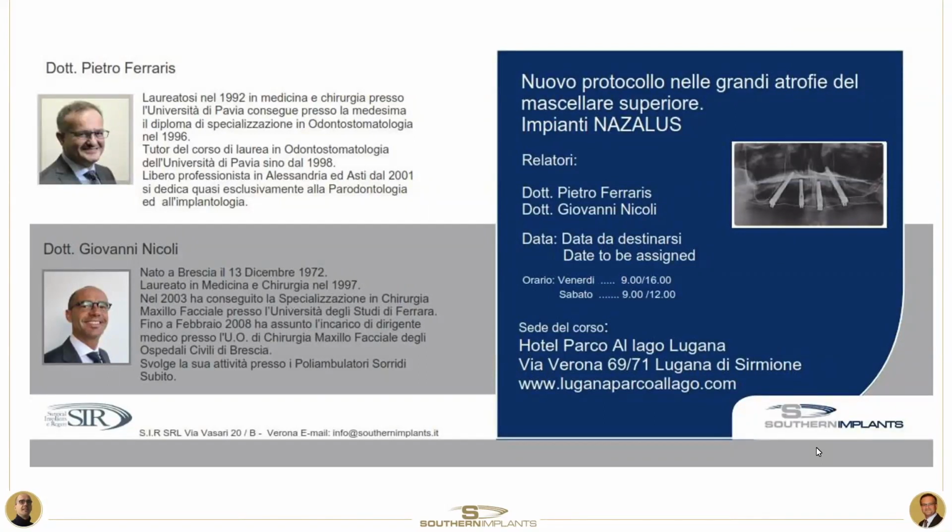Then Dr. Hamid asked, what graft material do you prefer to use for this implant? In reality, this graft is very simple, because you have 2 bone walls, and so the dissection of the mucosa is without tension. So in reality, you can put nothing if you want. It's not a problem. You can use anything. But in general, we use a xenograft or a PRF combination. We keep the bone from the patient, mix it with a xenograft, and use a PRF technique together. But you can use whatever you are used to using.